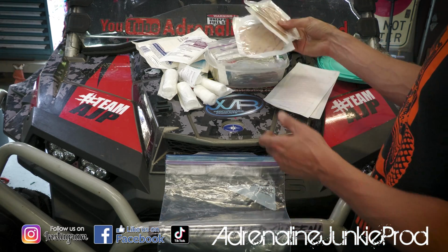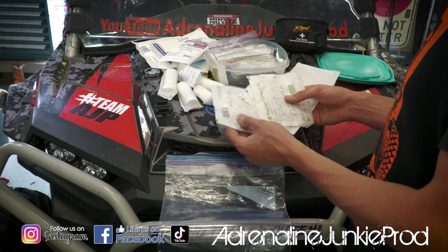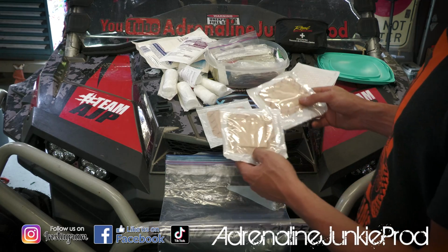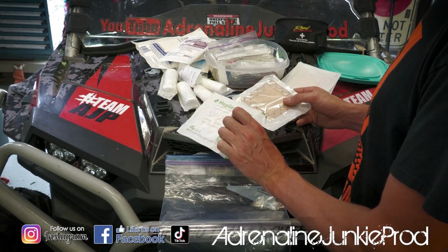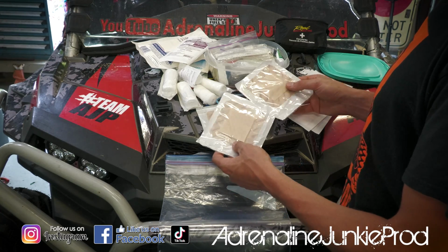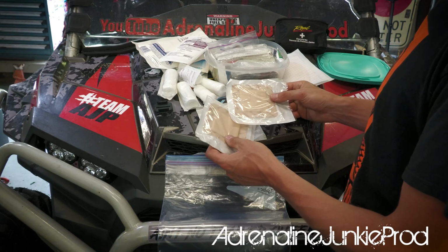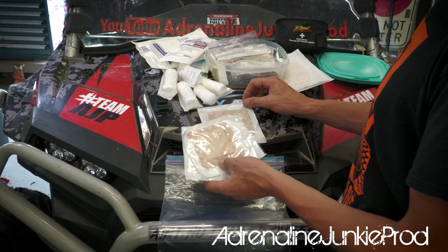Another thing you need is some bandages. I know what I use at the hospital. Since I work in healthcare, I do a lot of first aid stuff, a lot of trauma related stuff in the ER. These are dressings you'll see a lot in healthcare settings. This is the Mepilex Border. This is a silicone based dressing. It's very sticky, it's breathable, it conforms to wherever you want to put it. It stays on well, it comes off nicely.